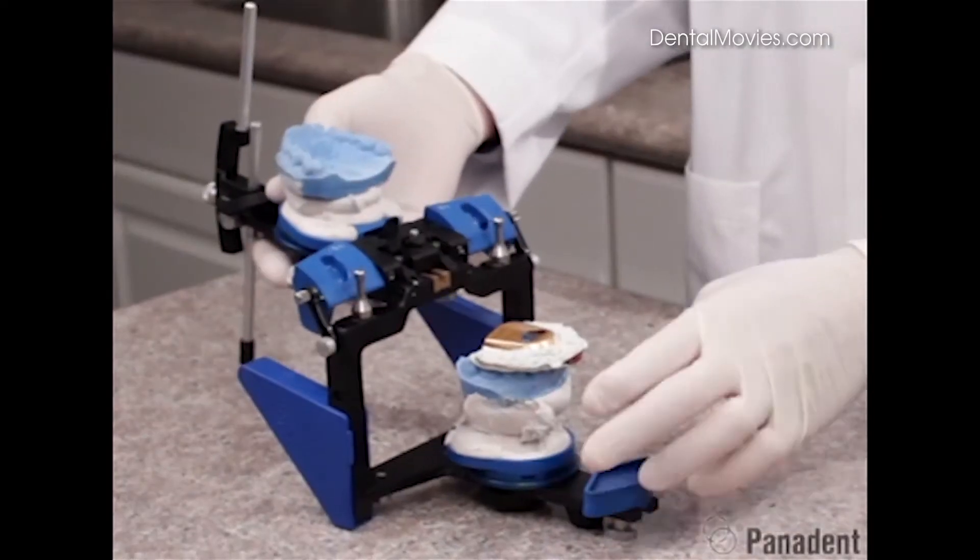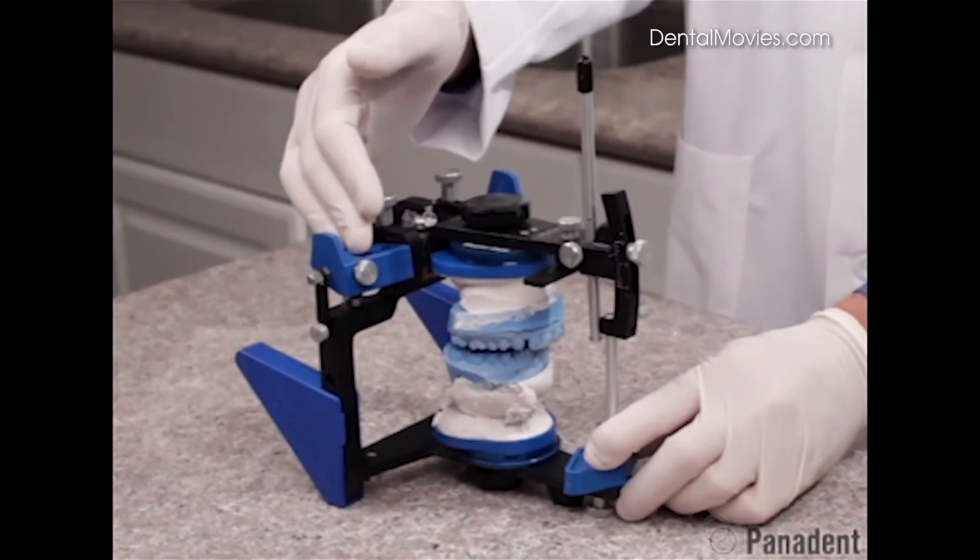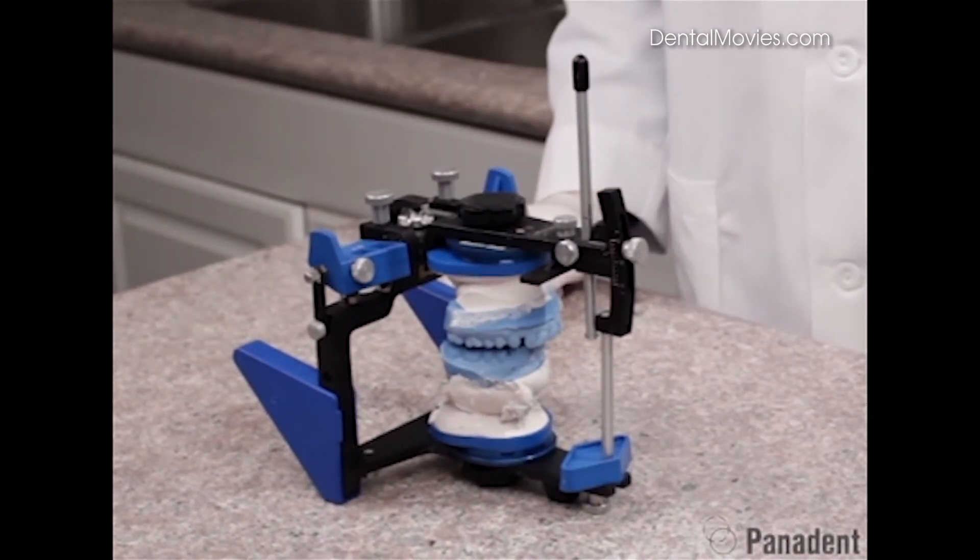We can then open the articulator up to remove the centric relation record. And we can now adjust the protrusive angulation using the protrusive check bite at this time.